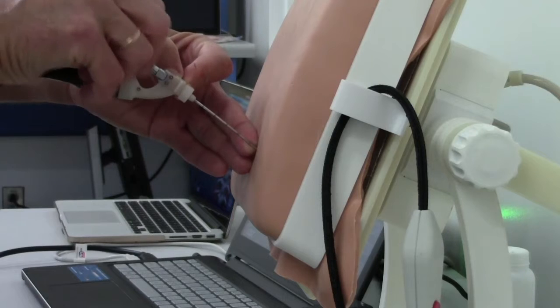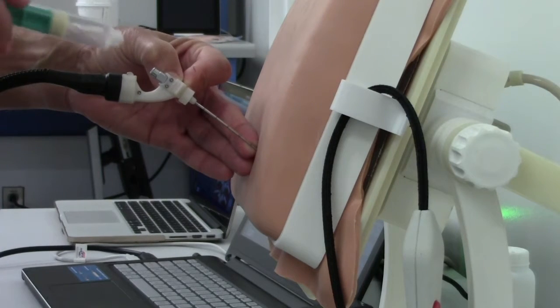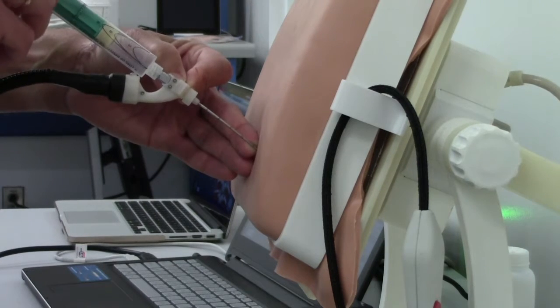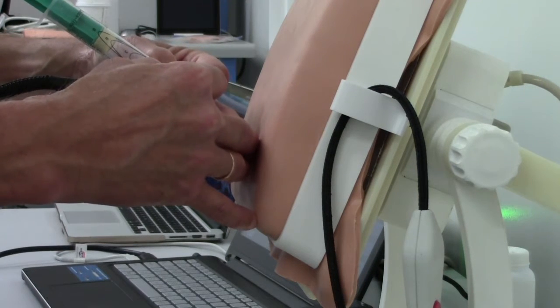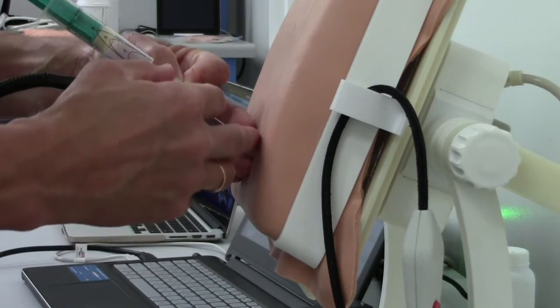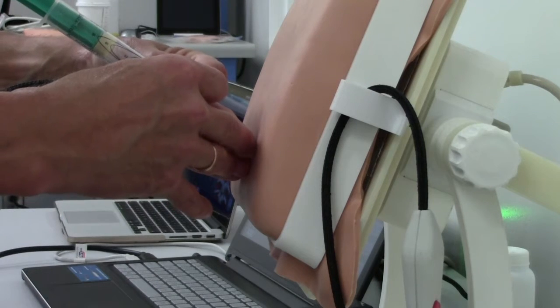After initial advancement, there is no loss of resistance. This probably occurred due to a suboptimal trajectory of needling. Note that the angle of the needle is significantly angled caudate. After noticing the depth of the needle at the skin, we start secondary advancement for 5 more millimeters or loss of resistance, whatever comes first.